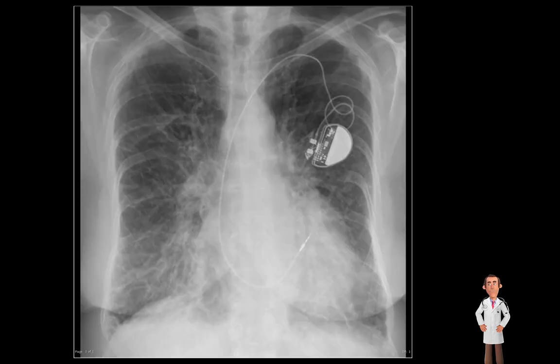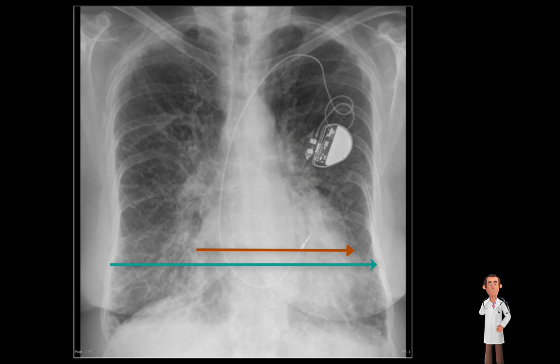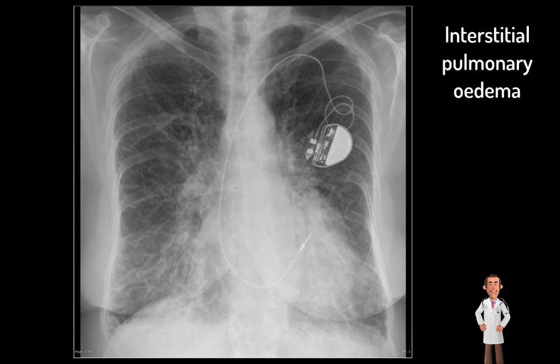Case three. In this radiograph we can see a single-lead permanent pacemaker in situ on the left. The heart is enlarged and there is a marked prominence of the interstitial lines and minimal blunting of the left costophrenic angle.